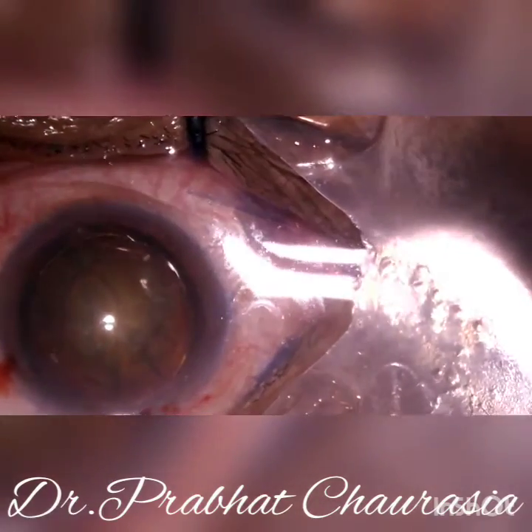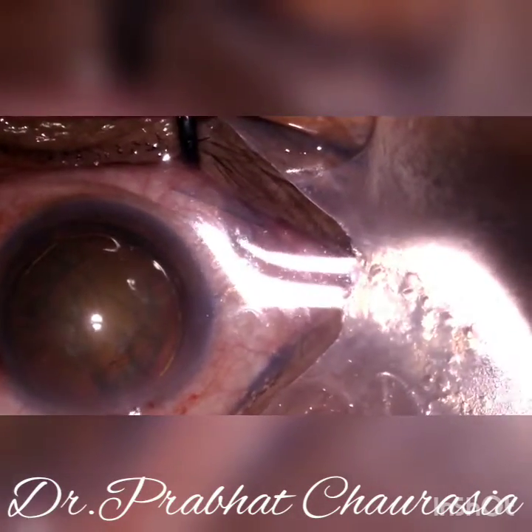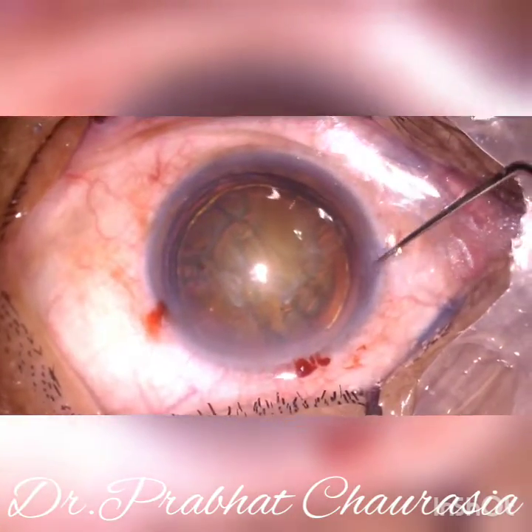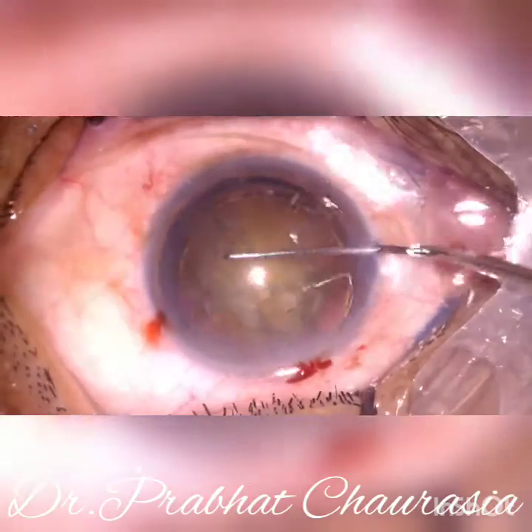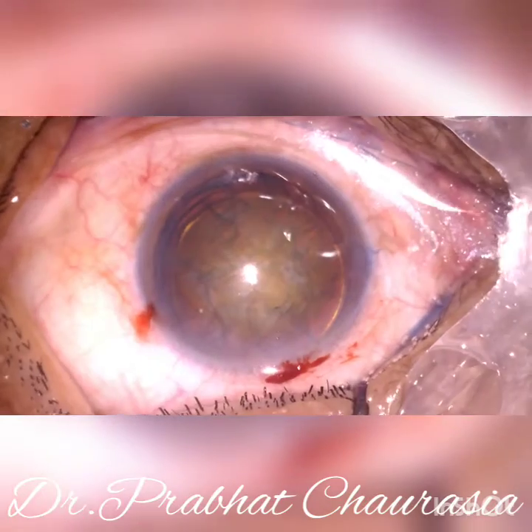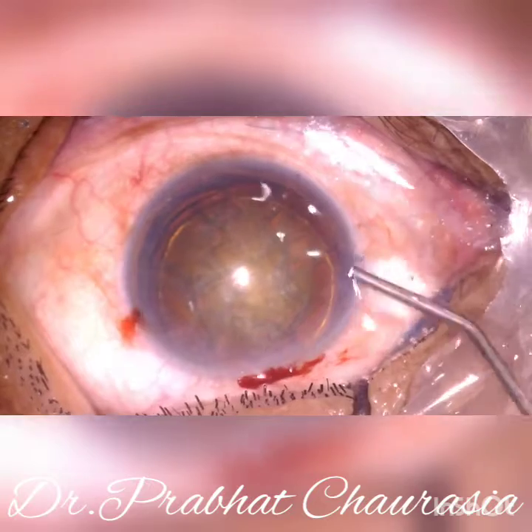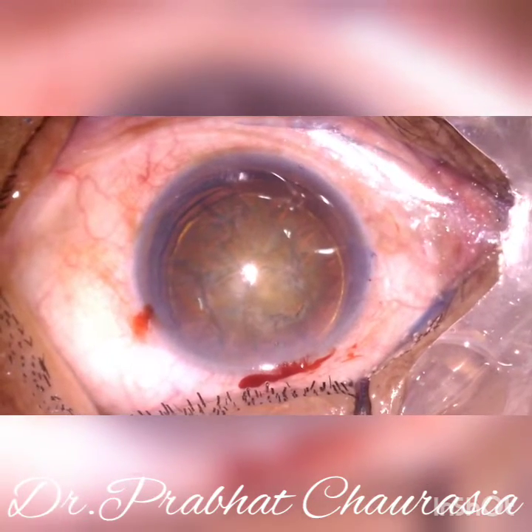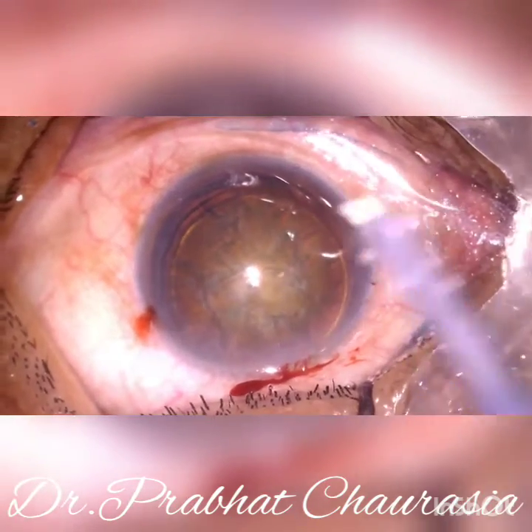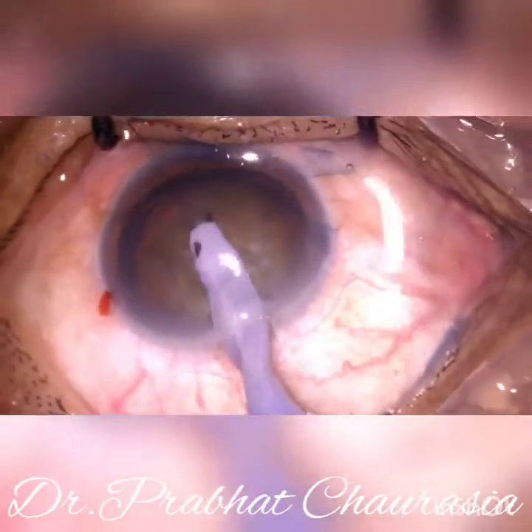After the hydroprocedure, inject some HPMC and then rotate the nucleus from the right side port. Rotation of the nucleus indicates there are no corticocapsular adhesions. Now I am starting phacoemulsification using a modified direct chop technique.